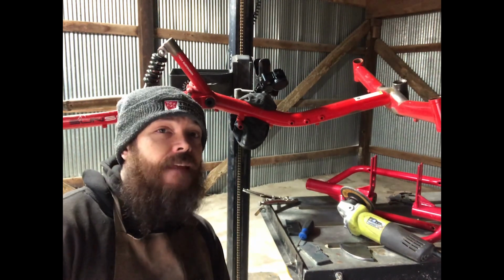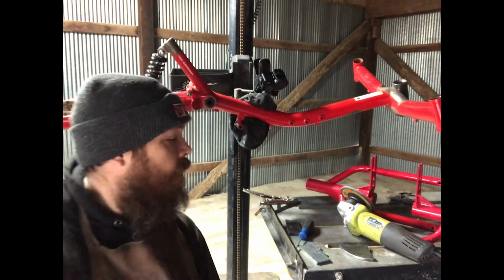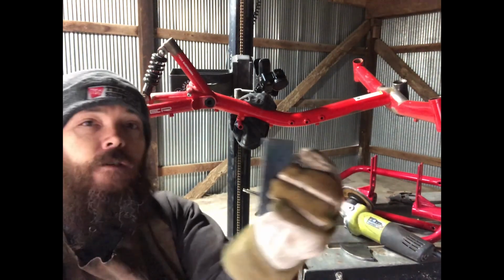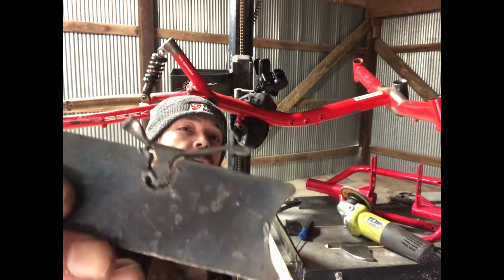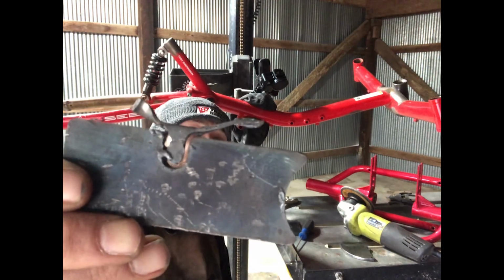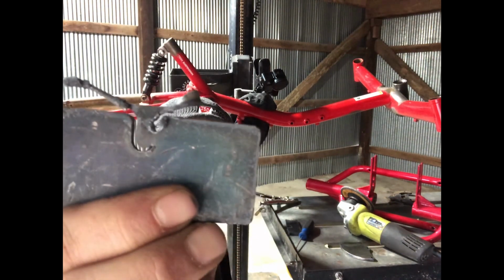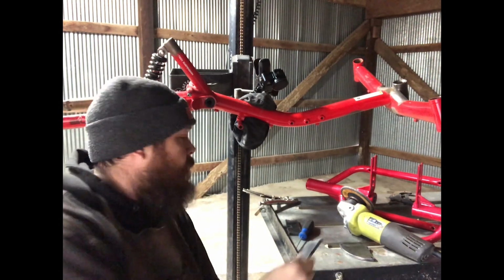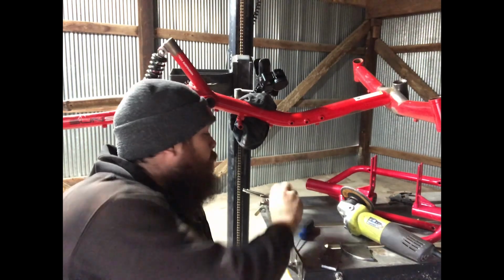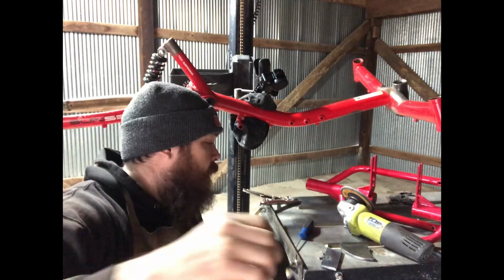Sometimes it can't even keep up with the amount of air that the plasma cutter needs to continue the cut, especially at the 1/4 inch. So that's what happened here. The plasma cutter decided to turn off, and at the last moment didn't cut the last little bit. You can see here on the back side it didn't even try to cut it. It just turned off. So something to think about if you're getting a plasma table or a plasma cutter. But otherwise, this is pretty much what they should be looking at, pretty clean.